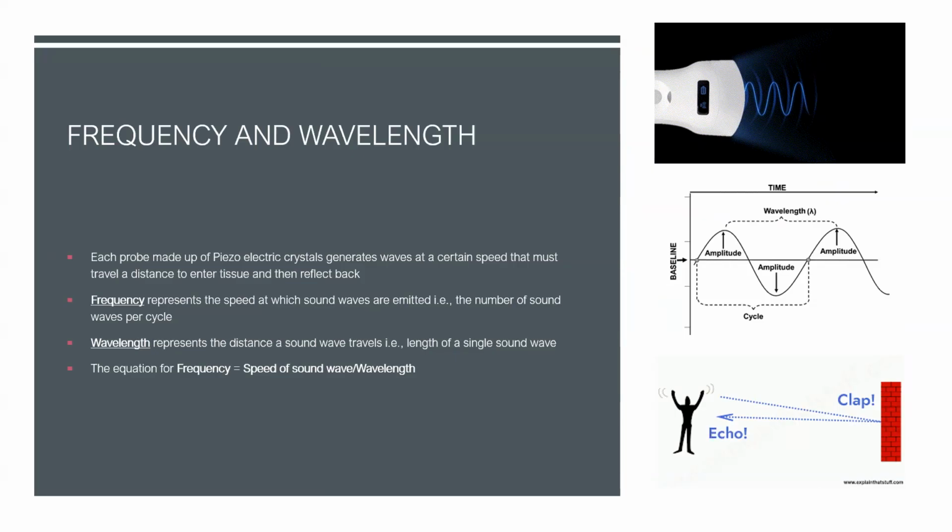I'd like to make this a little bit interactive. What frequencies do we normally use for cranial ultrasound probes? Anybody? Unmute yourself. 8 megahertz with the curved probe. Okay, why is that the case, Alberto? Why do we use 8 megahertz? Why not 5? Why not 12? Because the quality is worse with less frequency. Okay, you can go deeper, but you lose quality of the image. Very good, fantastic. Alberto has hit the nail on the head.